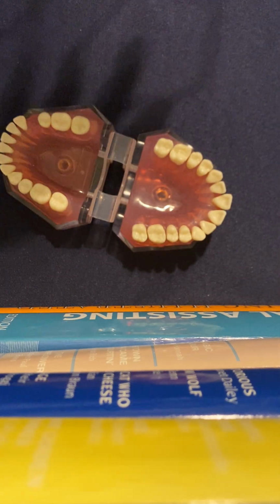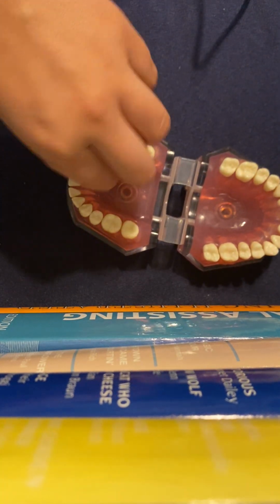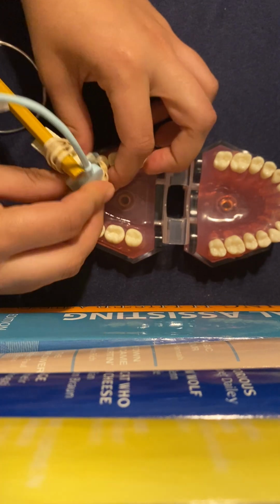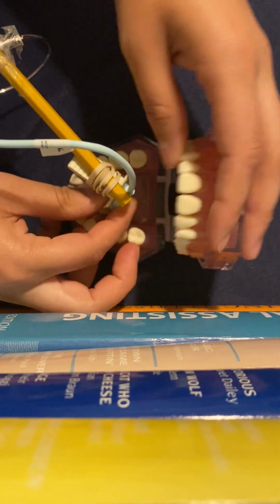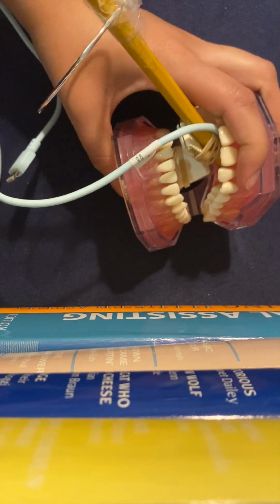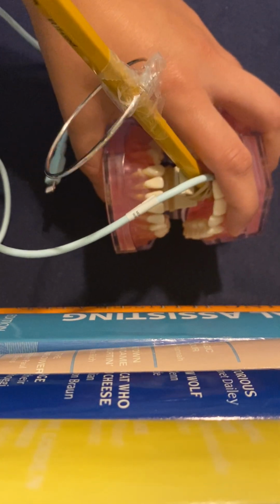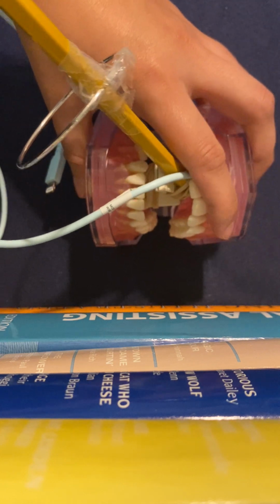Alright, next we're doing number 6, the mandibular right canine lateral incisors. So we're going to do this side. Grab your anterior bite tab. Going to get it in that midline, that sweet spot right there. And on this one, you're going to want to center it with the lateral canine. And the teeth that you're going to want to see are the distal of the lateral incisor and the mesial of the canine, the apices. And you're going to point from the ala to the chin corner.